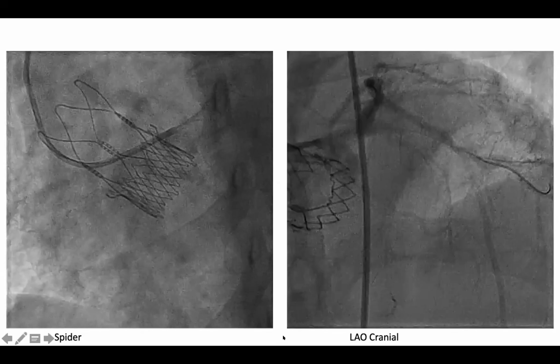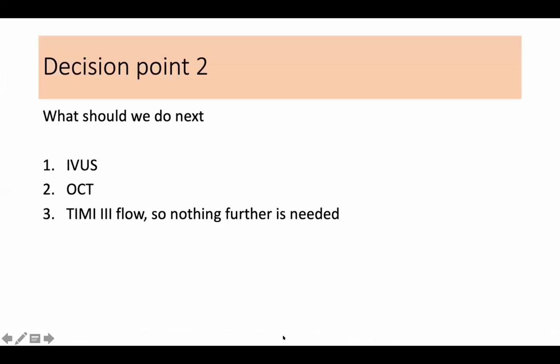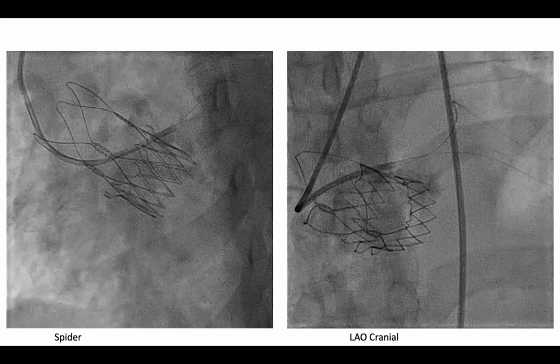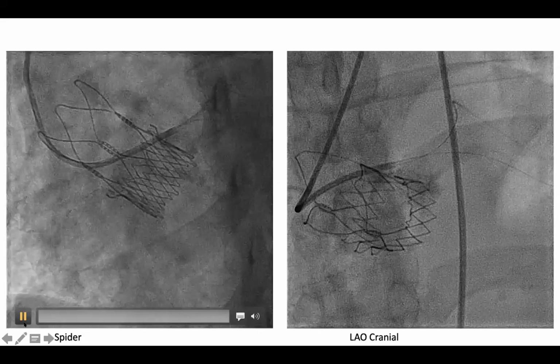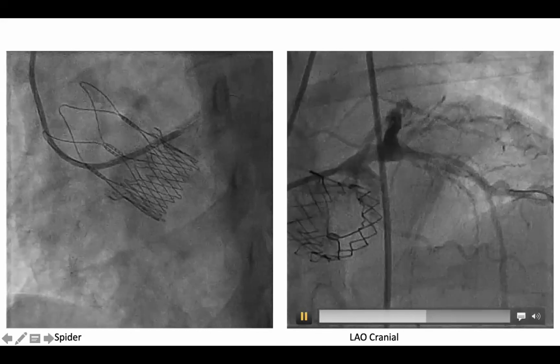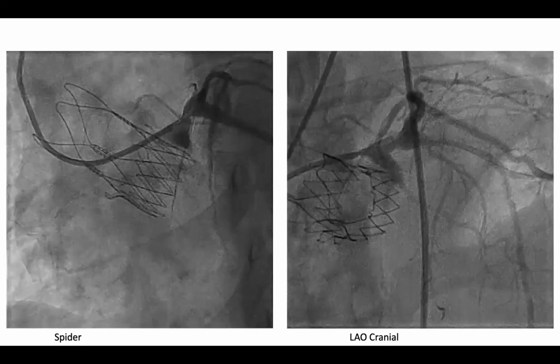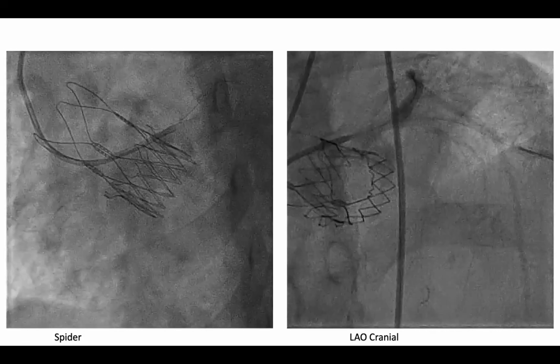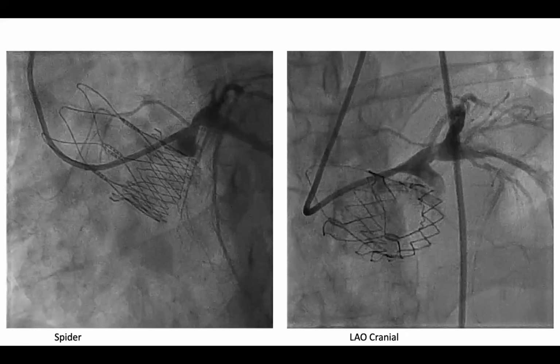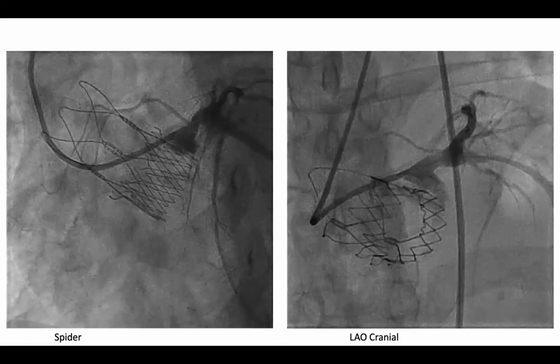Before you ask your question, Jawad, first you tell me that yes, we can go to this decision point in a moment, but this patient is in cardiogenic shock. More or less, yes. Whether left main is significant or not, we can come back to it. But there is TIMI 3 flow in all the vessels. Yes. So why do you think?